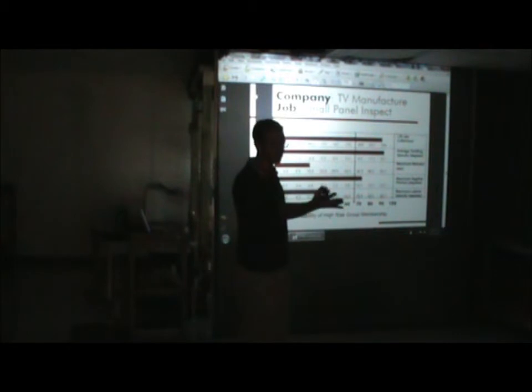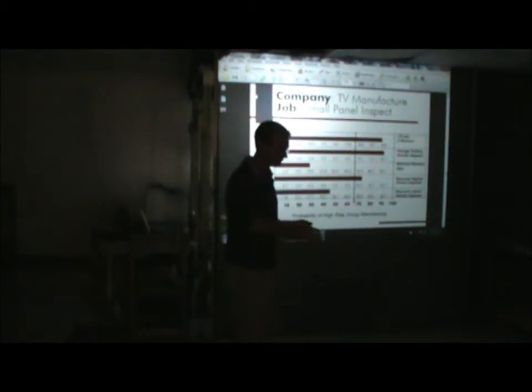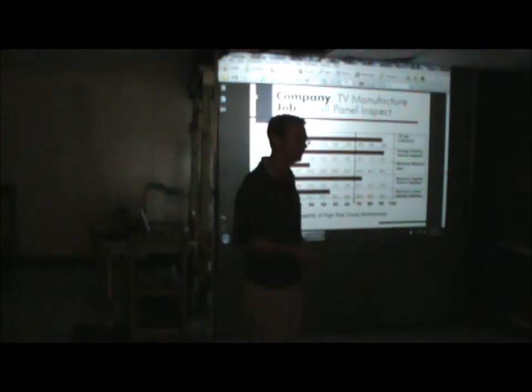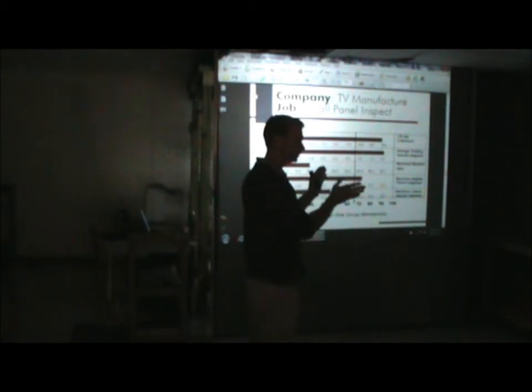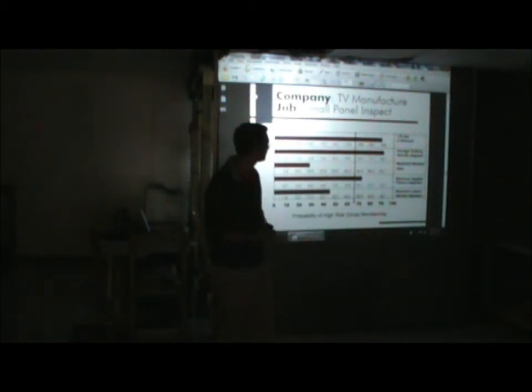So you could still certainly keep the device on there, and my recommendation for that example would be to break up that first lift and then stop collecting the data, and then you can start back with that second lift. And I'll show you how you can break that up. You're still monitoring that data all along, it's just how much do we want to save. You can save a chunk here and a chunk there without everything in between. You can specify that with the software. Did I answer your question?